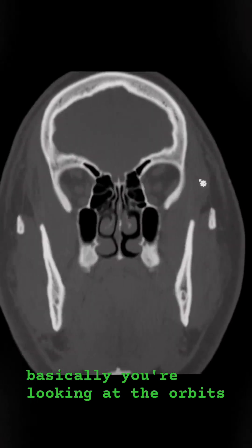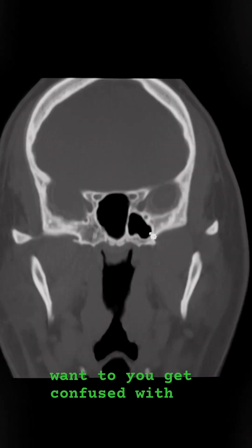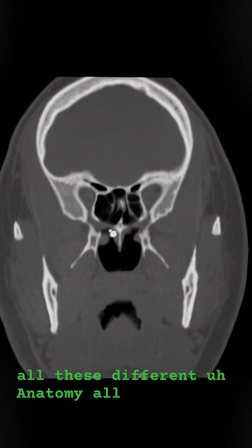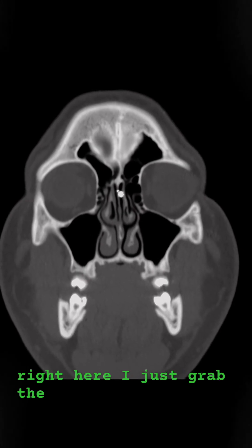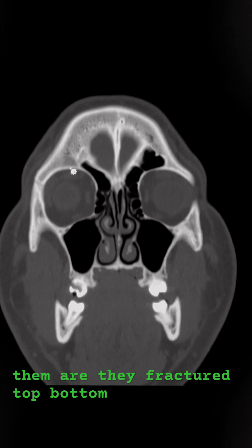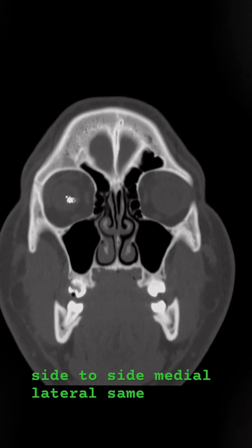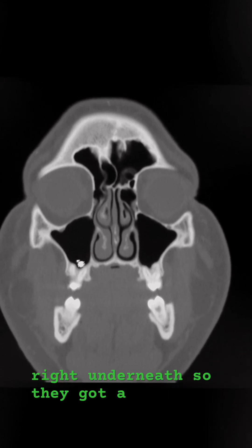When looking at the orbits, you don't have to scroll around and get confused with all the anatomy everywhere. Just sit right here — grab the orbits and sit on them. Are they fractured? Top, bottom, side to side. Medial, lateral. Same thing on the left. Same thing with the maxillary sinuses right underneath.